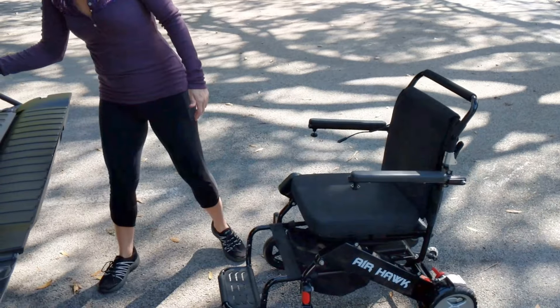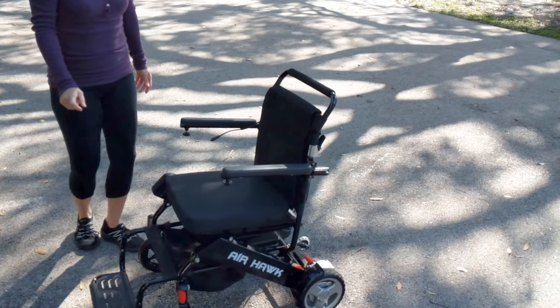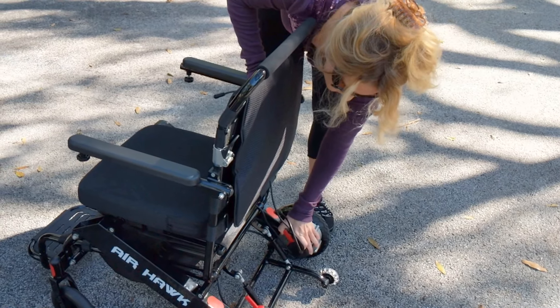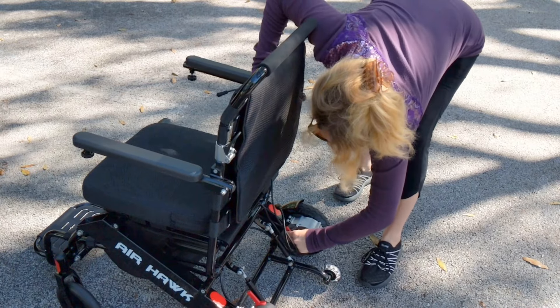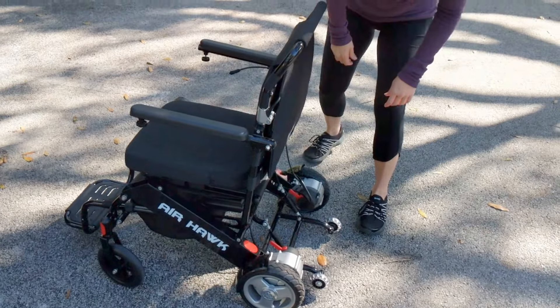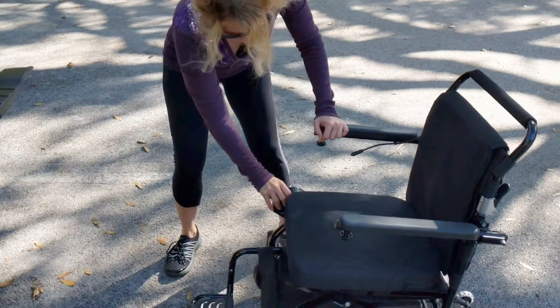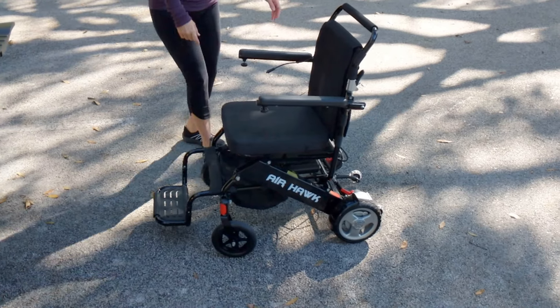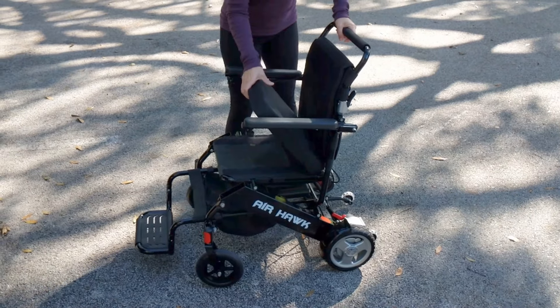We're going to take the spare battery out — you just took five pounds out of that chair. We're going to unplug the other battery. We're going to lock or unlock the chair to make the wheels very easy to deal with, just as easy as flipping a light switch. That other battery takes another five pounds out, so right now we're looking at a forty-one pound frame on that Airhawk.